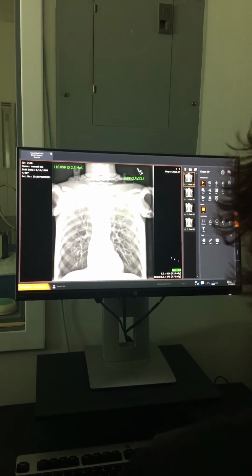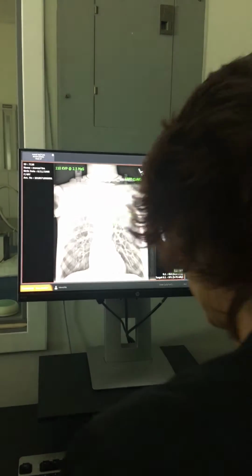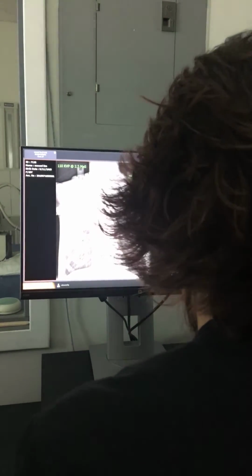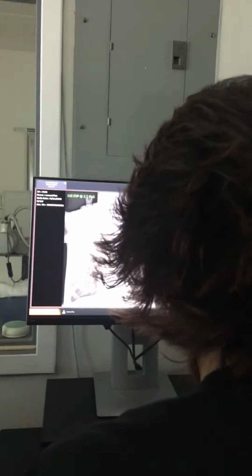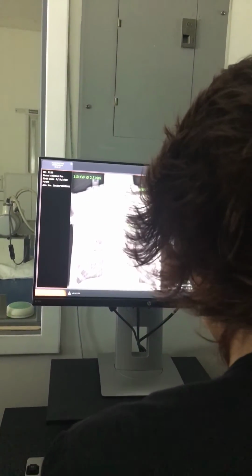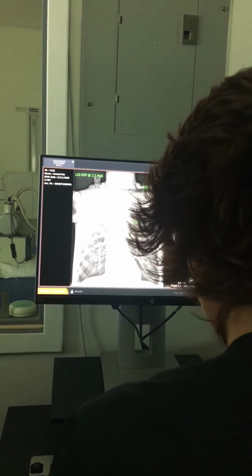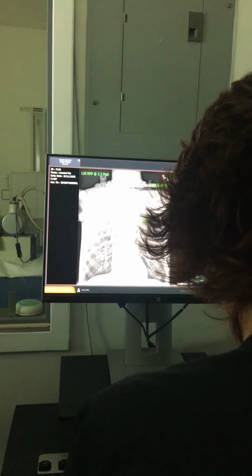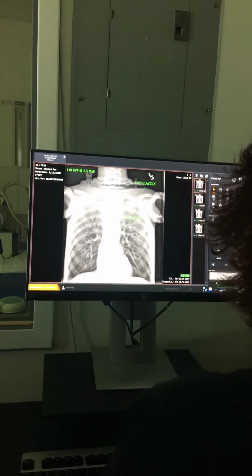Oh, where did it go? Crap. Would you not put the 48-inch with your technique? No, I mean, or does it matter? A lot of times they put it on there, as long as it's on there. Correct. I wonder where it went when I did that.